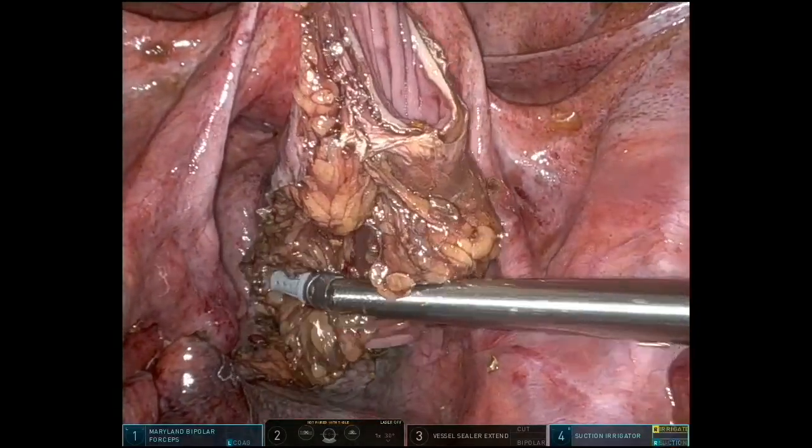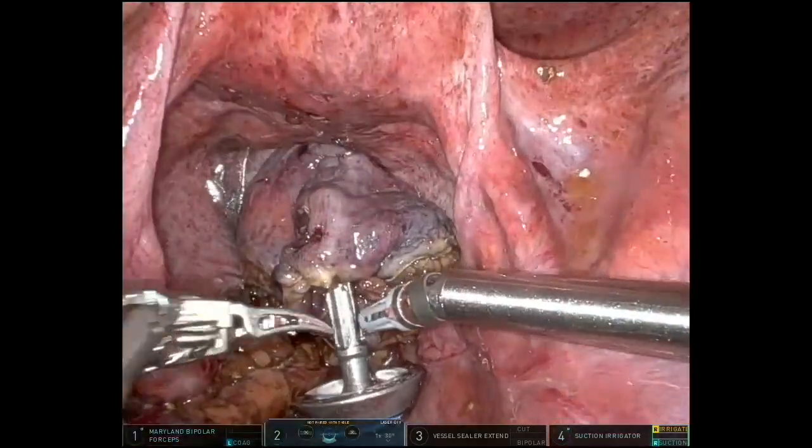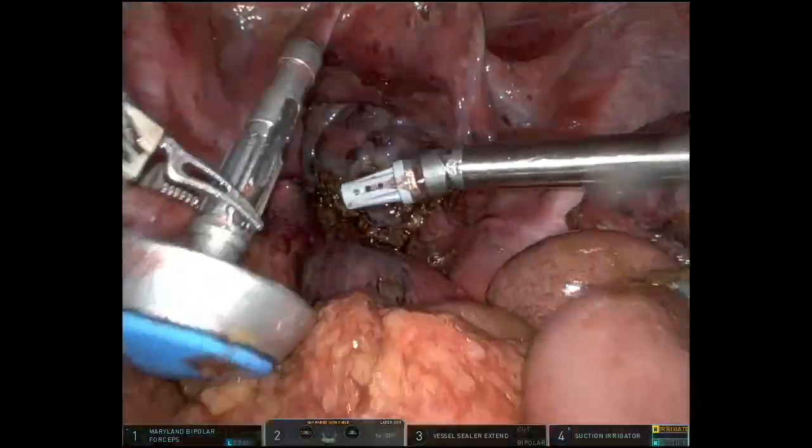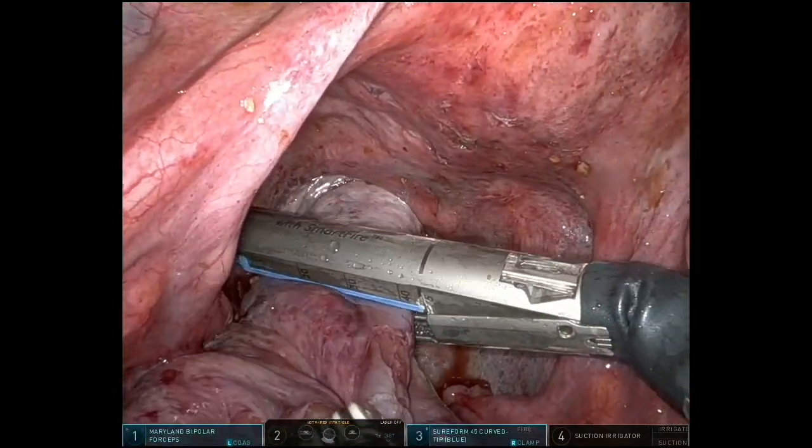This was followed by introducing the anvil via the ring forceps. The recto-sigmoid junction was prepared as well, using a 45 robotic stapler.